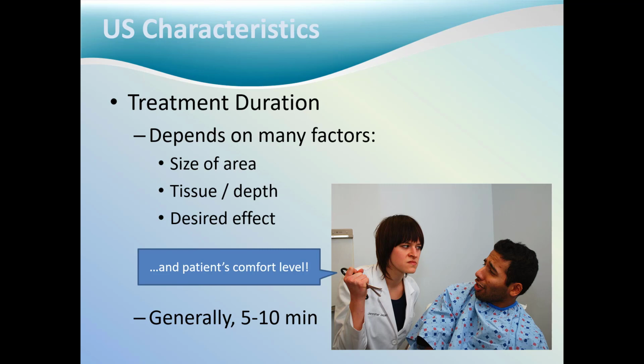The treatment duration is one of the most complicated things to figure out for a clinician. The treatment duration depends on multiple factors, including the size of an area, the target tissues or depth of treatment, and the desired effect of the treatment. In many clinical practices, general treatment time durations are between 5 and 10 minutes.